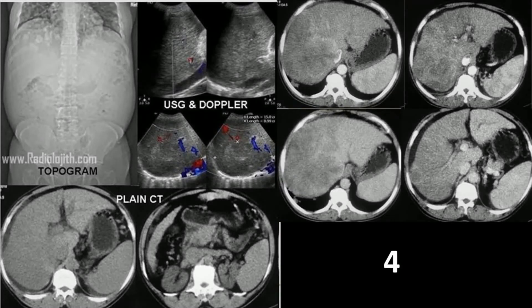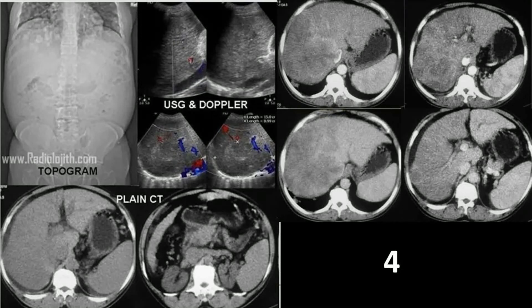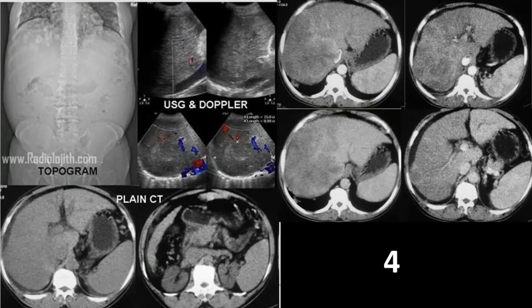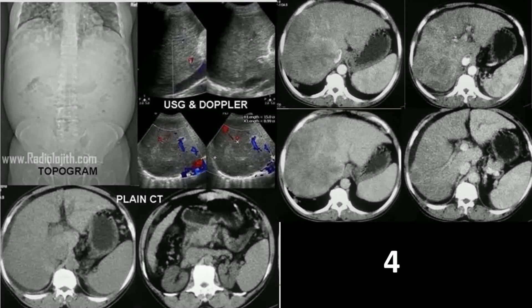There are too many findings — please give your attention. If you want more time, please pause the video. Take your own time and give the diagnosis.